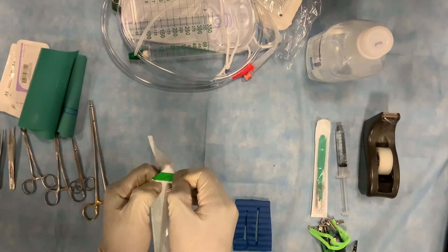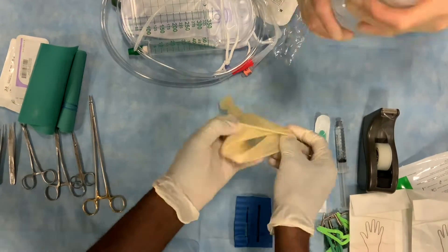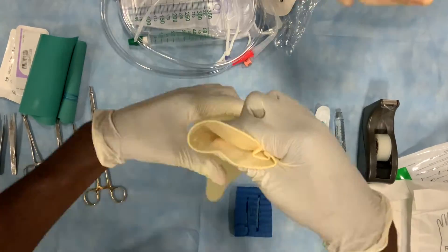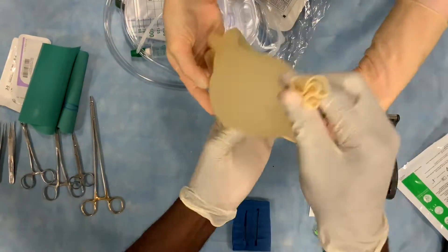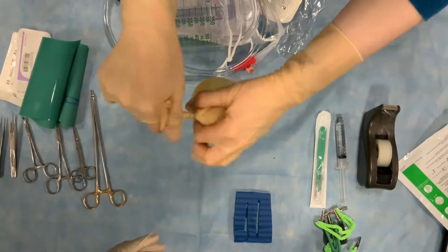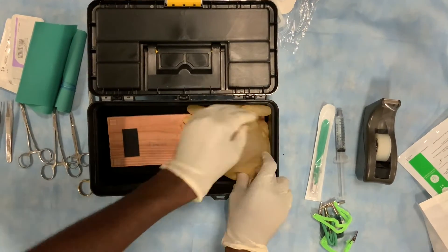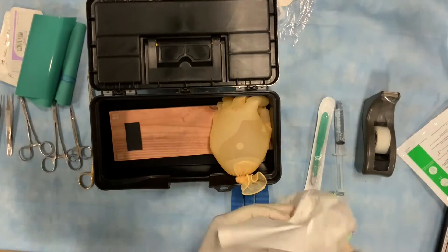First, we will prepare the distended bladder by pouring approximately 500 milliliters of water or saline into one of the gloves and tying the neck of the glove. We then double-bag it within the other glove and tie that off as well. We then place the distended bladder on top of one end of the overturned wooden board placed within the empty compartment of the global surgery box to create leverage.